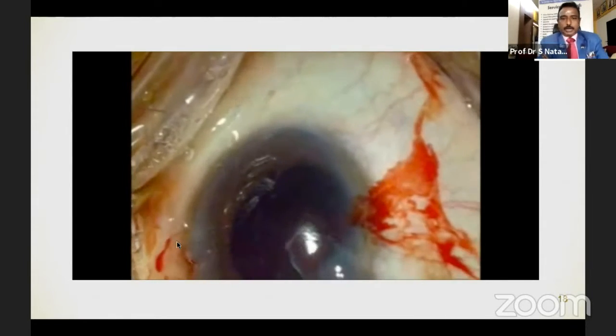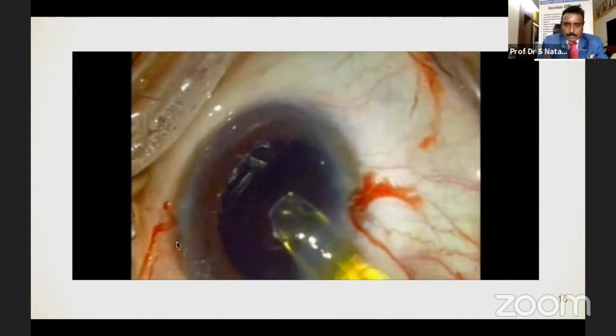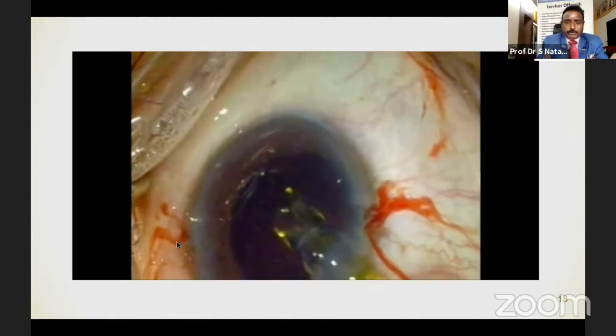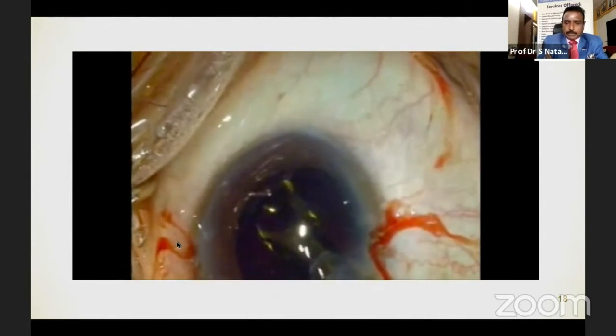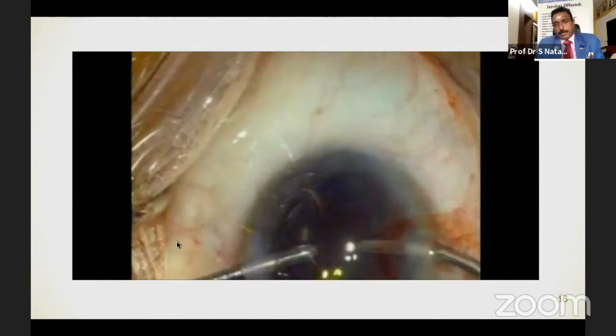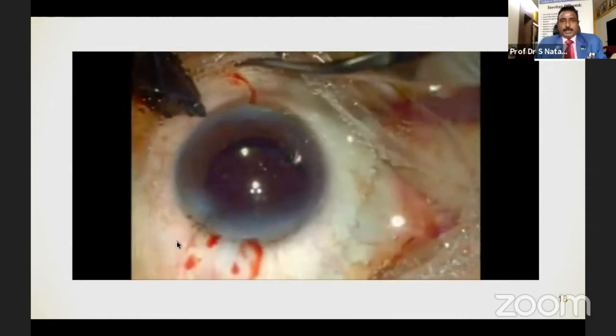And then here she's introducing the foldable intraocular lens. And the advantage of using the 3D is that a surgeon like Kavitara sometimes doesn't want to use the 3D, but she uses the binoculars and the microscope, because you can have the binoculars up when you're not using the 3D, but the recording will be in 3D.